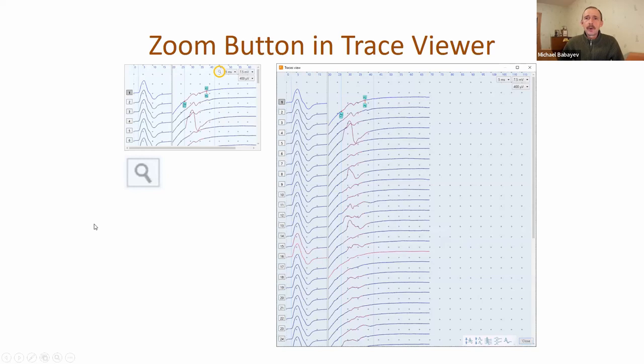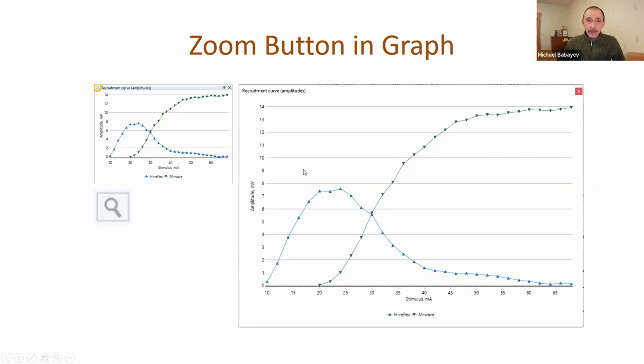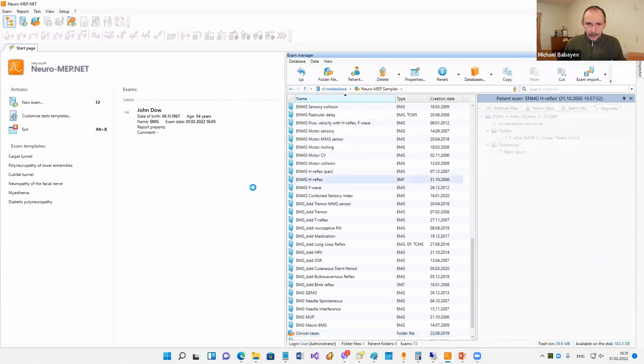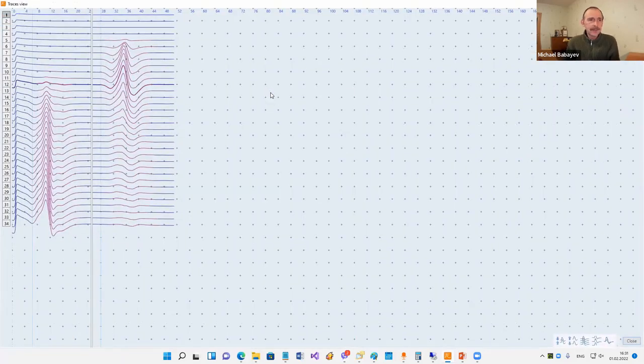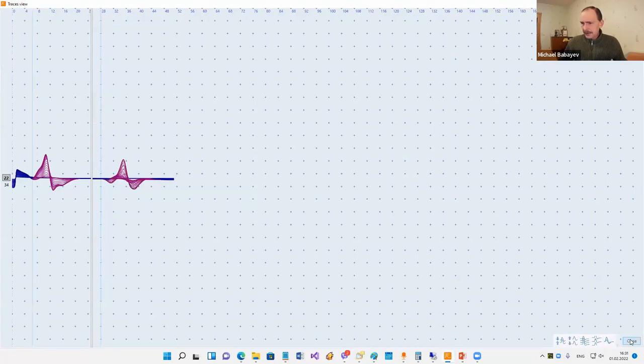We added a zoom button for the trace viewer. With this zoom button you can expand the trace viewer to full screen. We also added such a button for graphs and tables. For example, I can click these buttons and see only traces on the screen - all functions are still available, you can change marker positions or use context menu commands. To return, you click the Escape button or the close button.